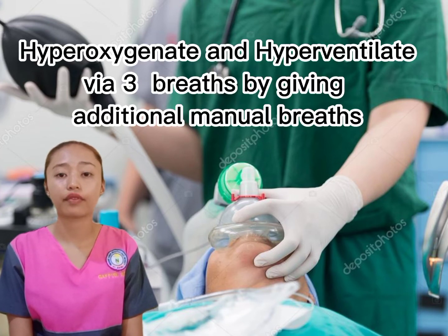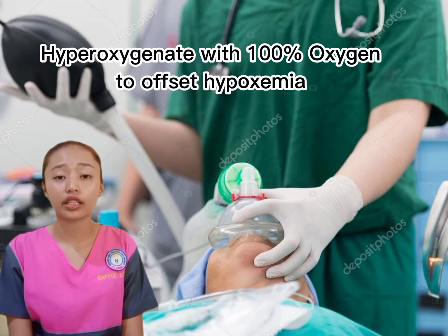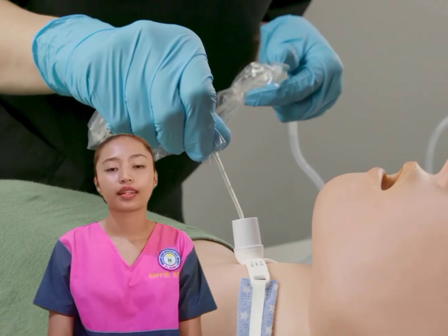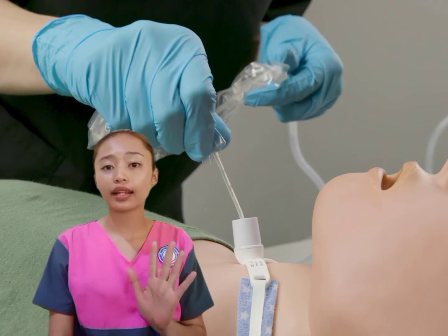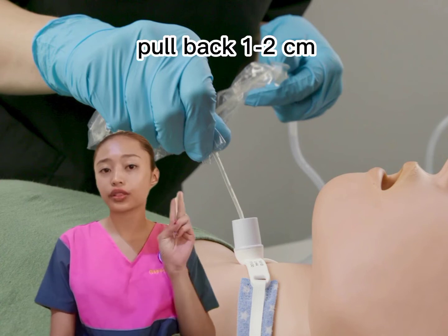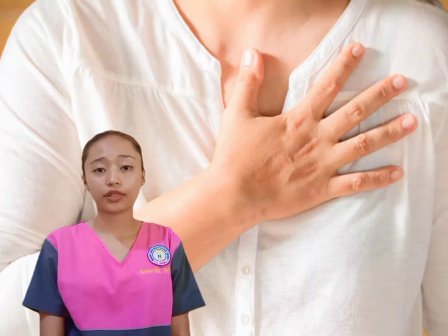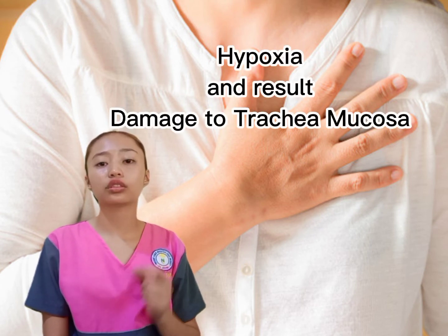Hyperoxygenate and hyperventilate via 3 breaths by giving the patient additional manual breaths on the ventilator before suctioning. Hyperoxygenation with 100% oxygen is used to offset hypoxemia during interrupted oxygenation and ventilation. Without applying suction, gently but quickly insert the catheter with the dominant hand during inspiration until resistance is met, then pull back 1 to 2 cm. The catheter is now in the tracheobronchial tree. Application of suction pressure upon insertion increases hypoxia and results in damage to tracheal mucosa.